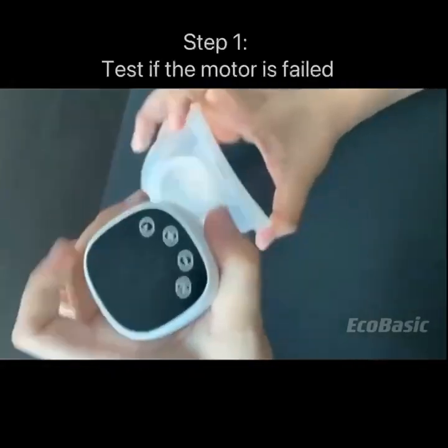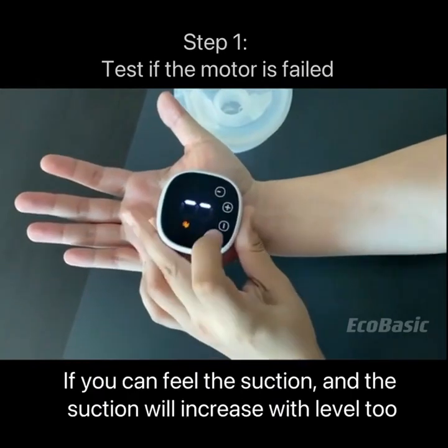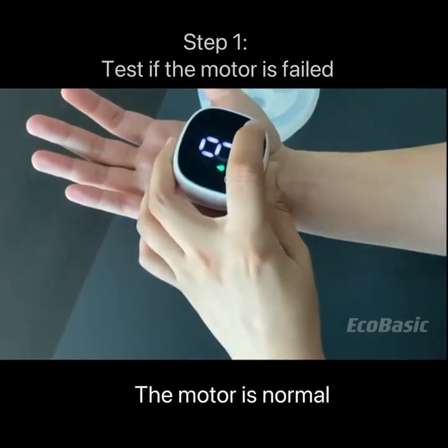Step 1: Test if the motor has failed. Put it on your hand and feel the suction. If you can feel the suction, and the suction will increase with level 2, the motor is normal.